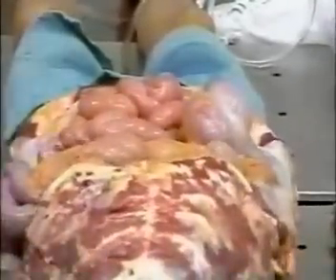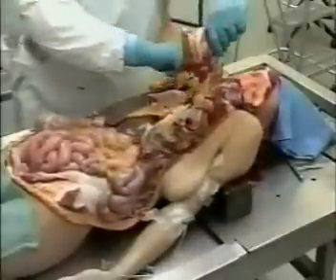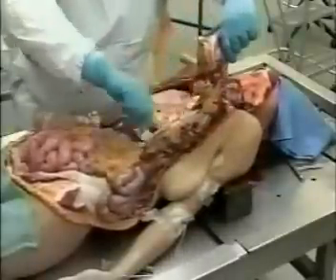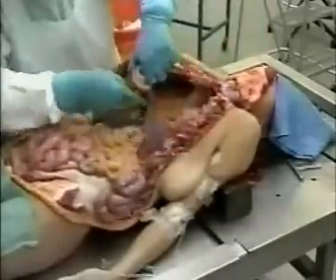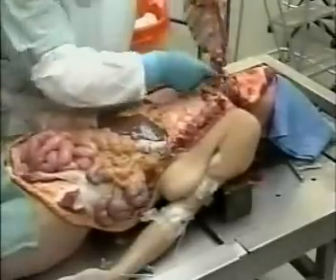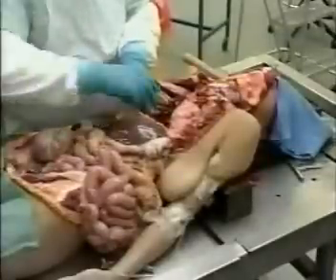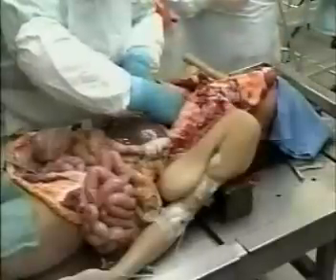Now the ribs are being cut so that the chest cavity can be exposed. He's also cutting the next portion of the diaphragm and reflecting back the chest plate in order to expose the heart and lungs. Now you can see the heart and lungs in place. What he's doing now is cutting the pulmonary artery and checking to make sure there are no blood clots in there.